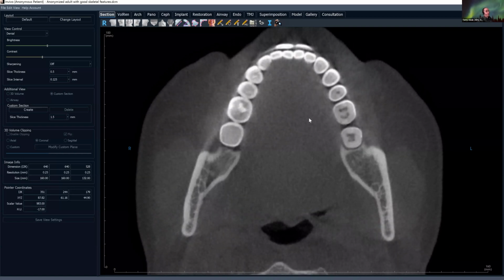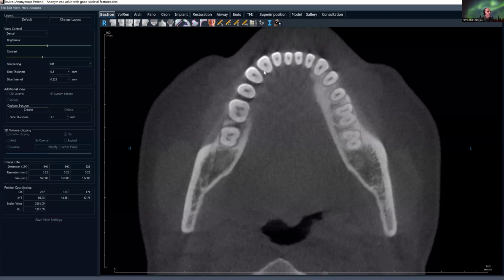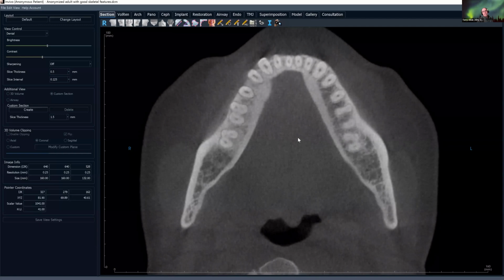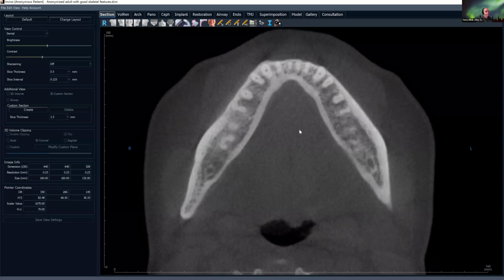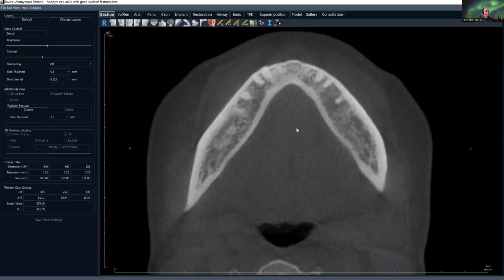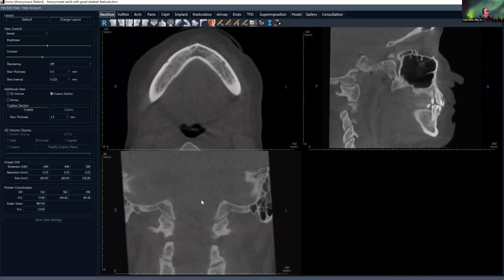I'm going to be coming into the occlusal aspects of the mandibular teeth. And right about this point, again, I want to pause and kind of go through and look at all of this. I selected a case that's more or less pathosis free just for demonstration purposes. In my other continuums, I have incidental findings and the things that kind of scare us as dentists and radiologists. And I scroll. Now I'm done here. I click out of here.